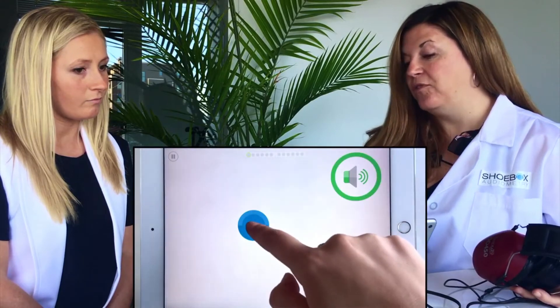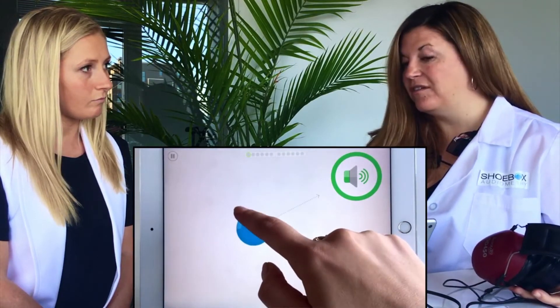If you like, you can actually touch the blue disc multiple times if it helps you detect whether or not a sound is present, or if you have ringing in the ears, that can also be quite helpful.